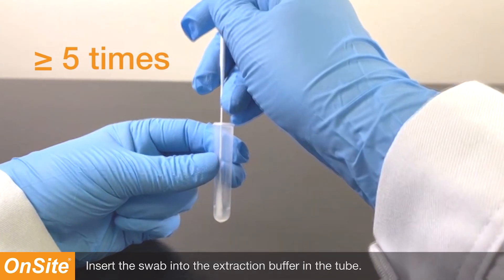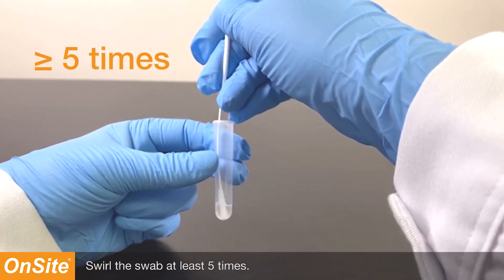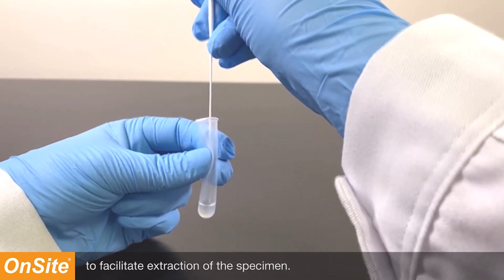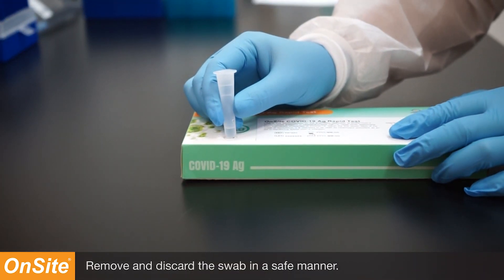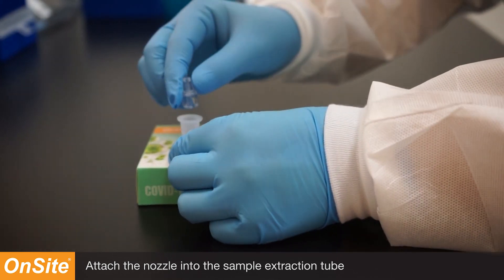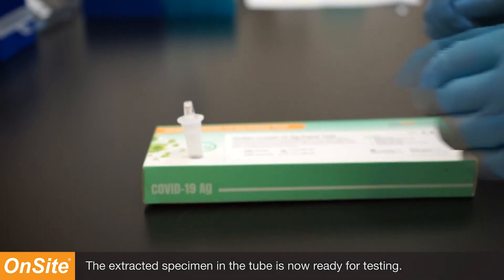Insert the swab into the extraction buffer in the tube. Swirl the swab at least five times. Squeeze the tube against the submerged swab several times to facilitate extraction of the specimen. Remove and discard the swab in a safe manner. Attach the nozzle into the sample extraction tube containing the extracted sample. The extracted specimen in the tube is now ready for testing.